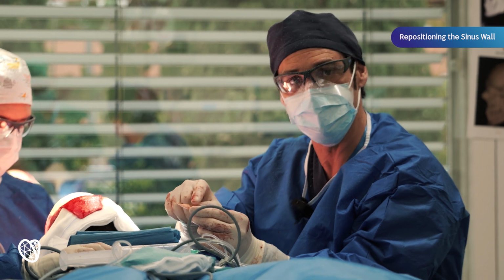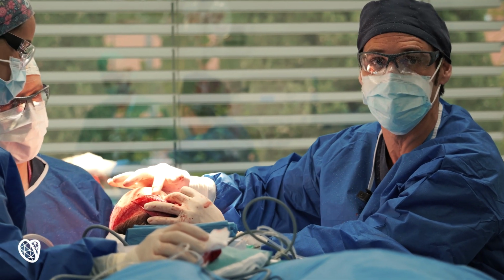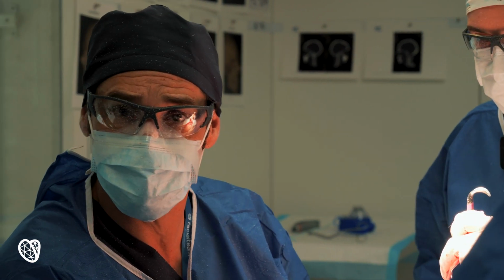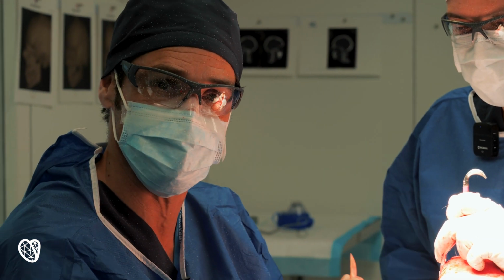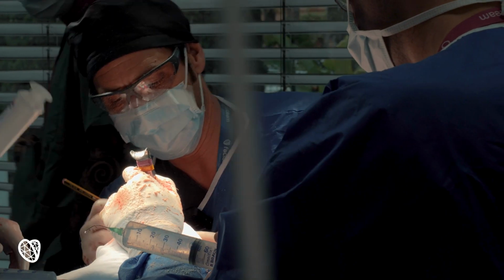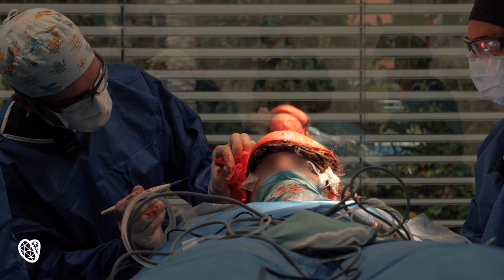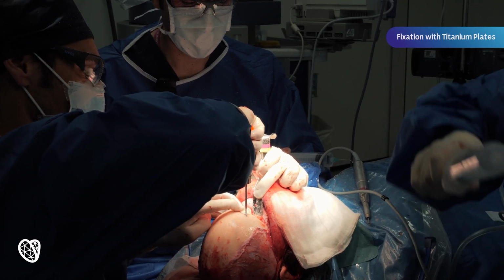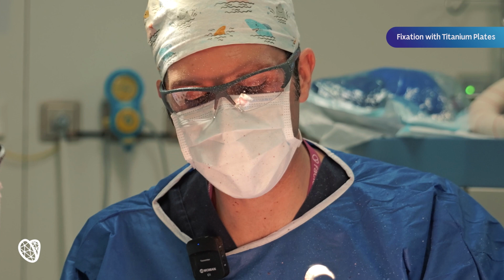Now we are going to soften the inner wall of the bone, and after this we have to close the sinus according to the new shape surrounding. So it's when the proper reconstruction begins. Surprisingly, and probably this is the magic of forehead reconstruction, now the anterior wall is bigger than the sinus, so we need to adapt it. In this case, we use only 2 plates to fix the anterior wall of the frontal sinus.